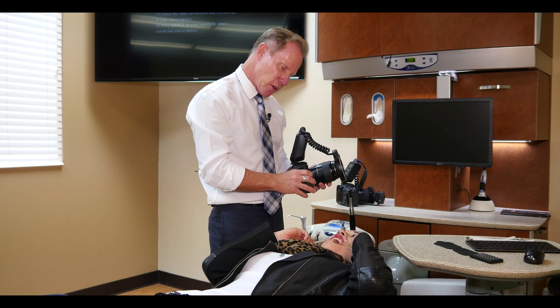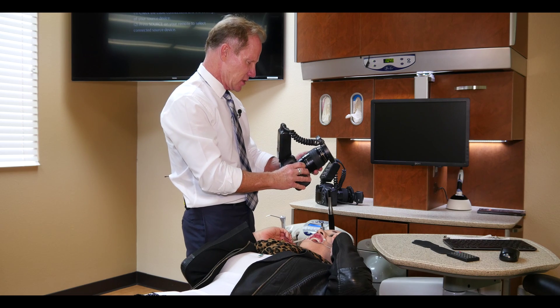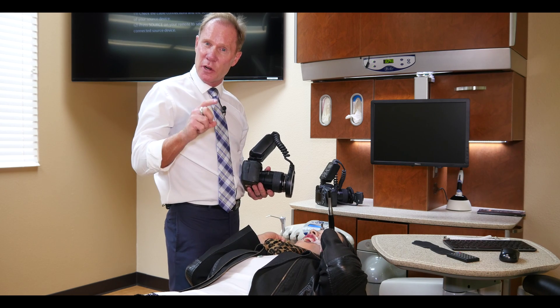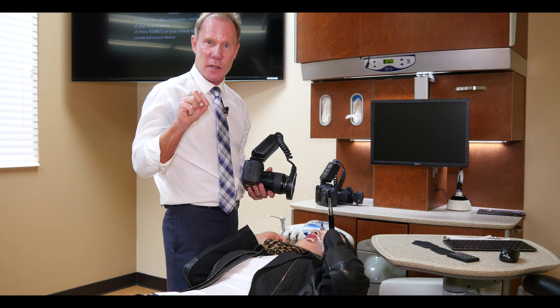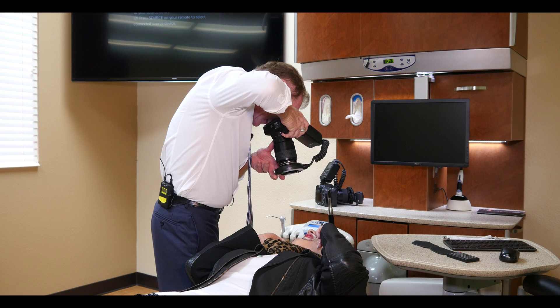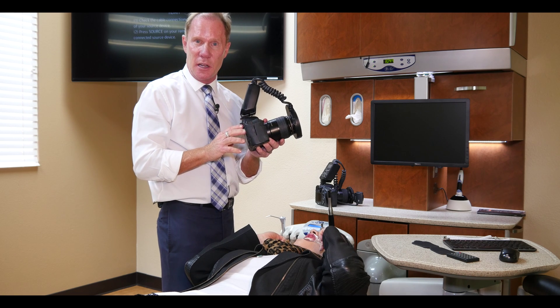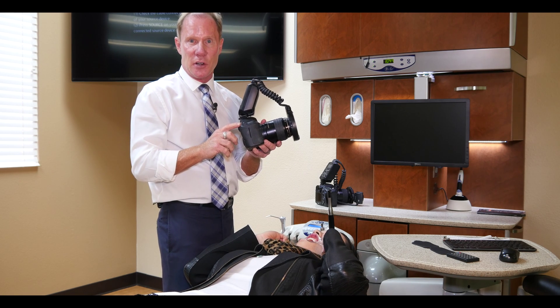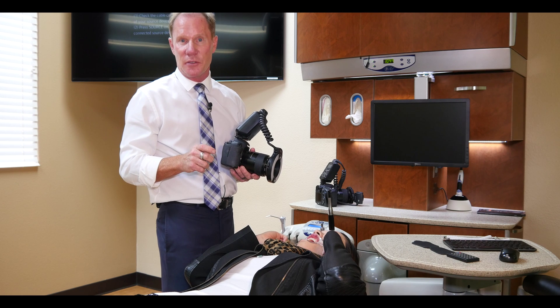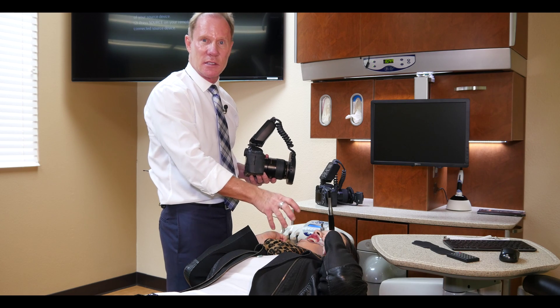We're now going to take a retracted frontal view at a one-to-two ratio, so I'll set the lens at two. My goal is to have her close down as much as she can while still having a little opening so I can see the incisal edge. Tongue back. I'm still shooting at a shutter speed of 60 and an f-stop of 32 — shooting at f-stop 13 or lower cuts down the depth of field. I want an image where the incisal edge is in focus as well as even the second molars.